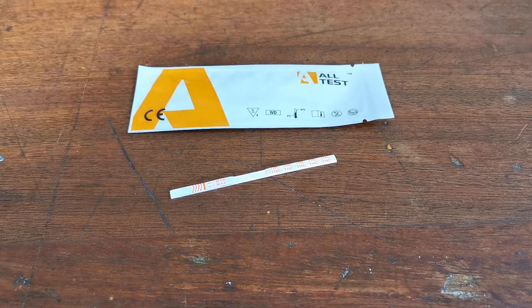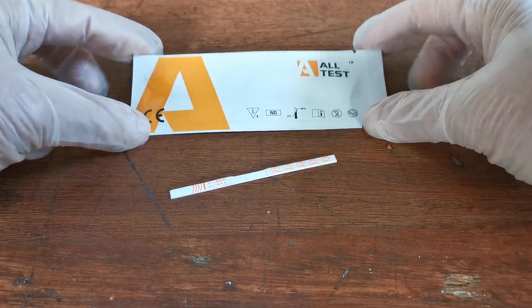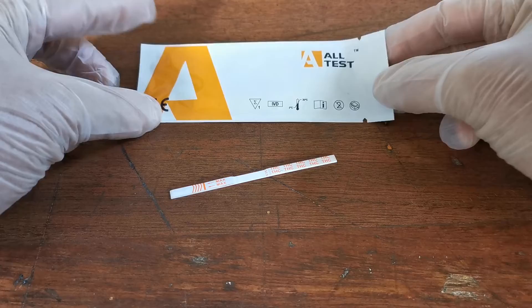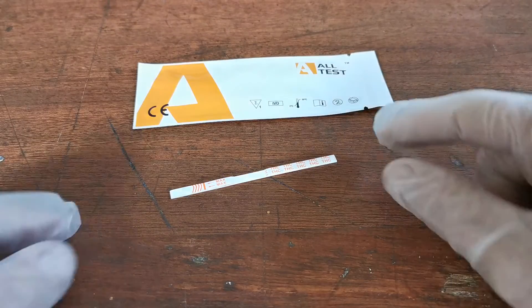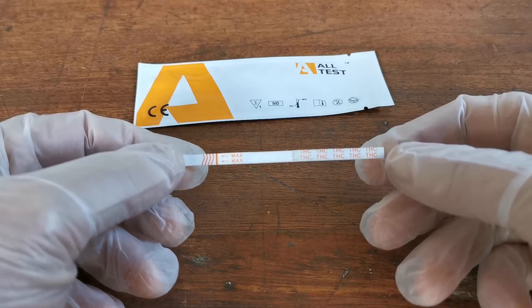Welcome to this combined UK Drug Testing and Value Med presentation video showing you the Alltest dip cannabis test strip. The foil that you will receive is the standard Alltest branded foil that contains a single test strip, and here is the example cannabis test strip that's been removed from that foil.